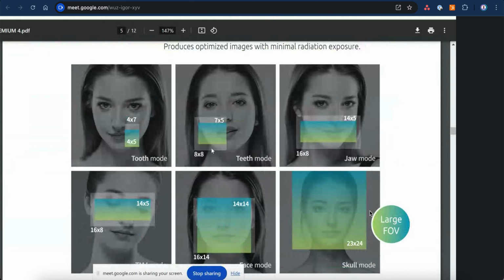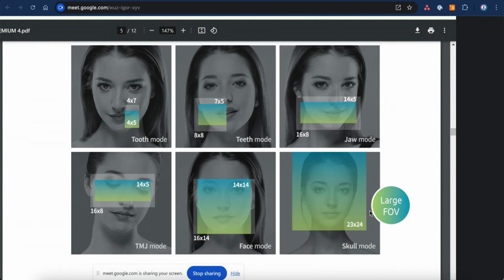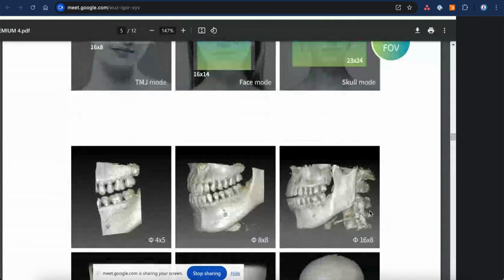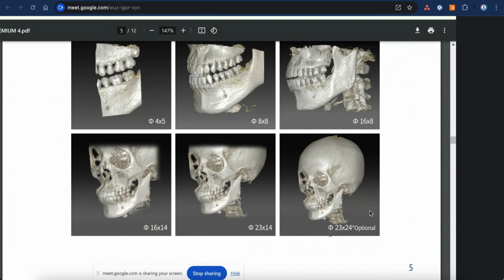This is the CBCT. Can you see the different fields of view that we have here? The smaller the better, not the better, but according to the treatment needed, and the more broad the field of view, the better. Oh my God, I can have a field of view of 4x4. X-ray companies compete in these things. This is how it appears, 4x5, this 8x8. This, for example, 23x24.